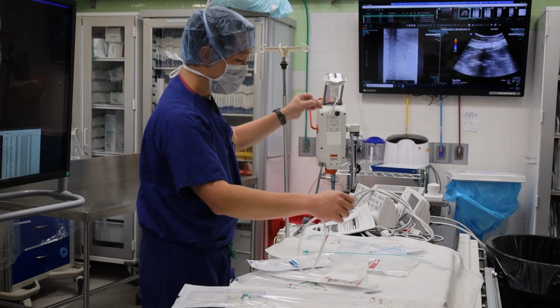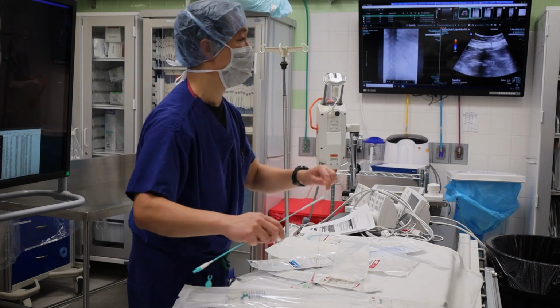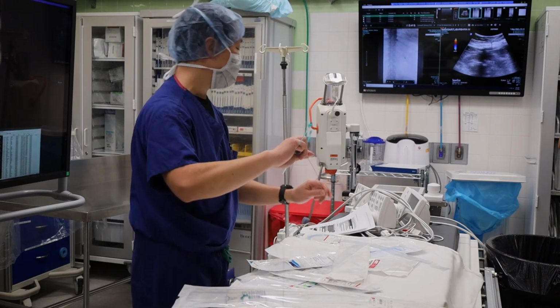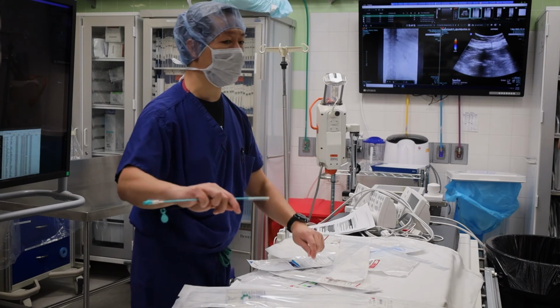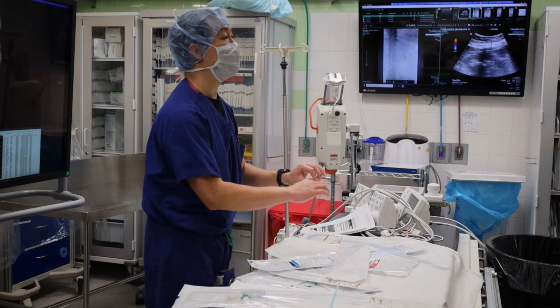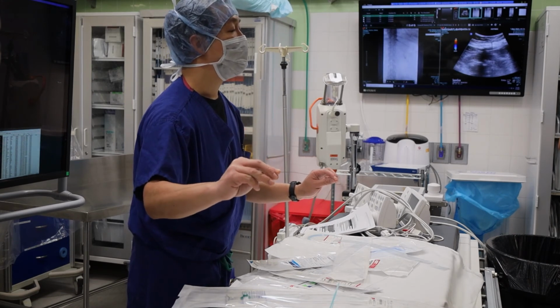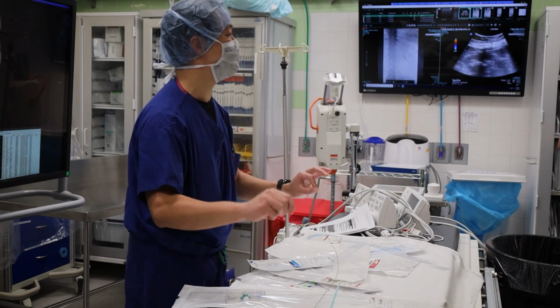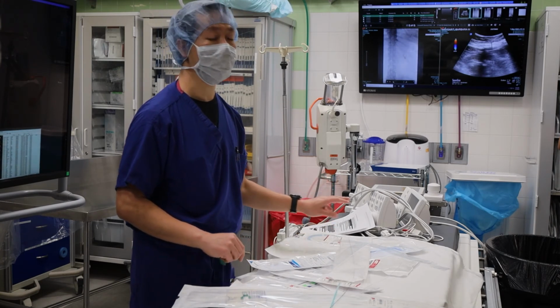The other thing is that when you're loading something on, one thing that I see people do is they put it on, and then when they're advancing it, they pull. Very common, okay? Don't pull. When you're advancing this, always have slack so that you're advancing it over the slack. And look at the patient and see if that doctor is now doing something else, like staring at the ceiling or whatever. They're not holding the wire, because people have lost access putting on tubes. We don't oftentimes mention it, but when we're holding it, you can actually feel the other person going tug, tug, tug when they're loading things, and we feel it. So just a word, a trick of the trade, be mindful of that.